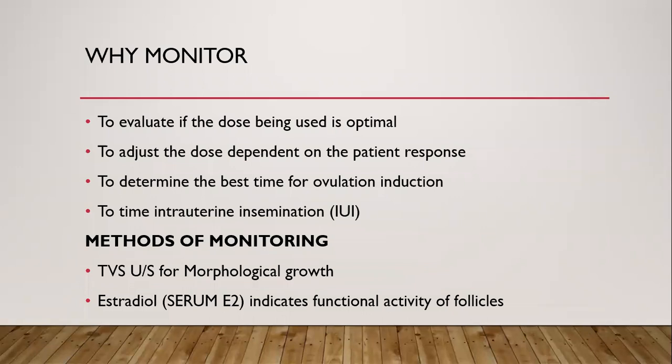Now, this one is typical of the endometrial cavity. So they need to time intrauterine insemination at a time when the uterus is actually ready, dependent on the thickness that we get to find as we scan our mothers.